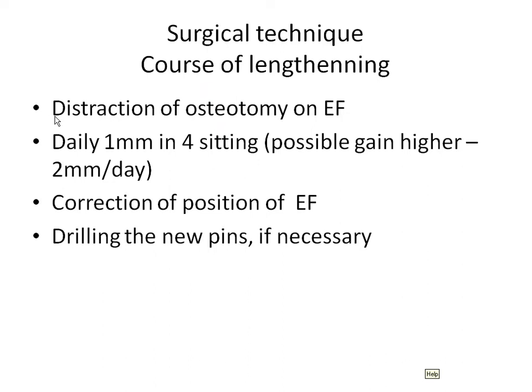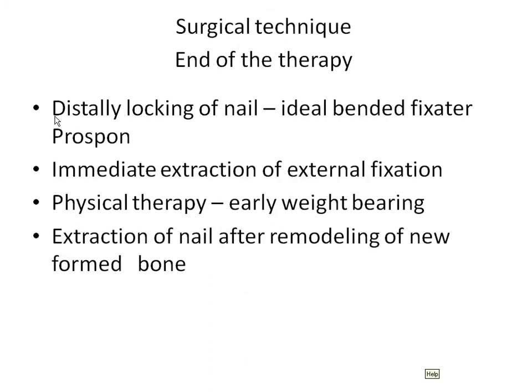clear. Distraction of the osteotomy we make in four daily sittings, 1 millimeter a day, so a quarter of a millimeter every 6 hours. We tried to make it a little bit quicker, and it doesn't seem to do any harm to the development of the bone, but the patient doesn't like it very much. We can, of course, make correction of the position of the external fixation. That means that we add a new pin if it is necessary.